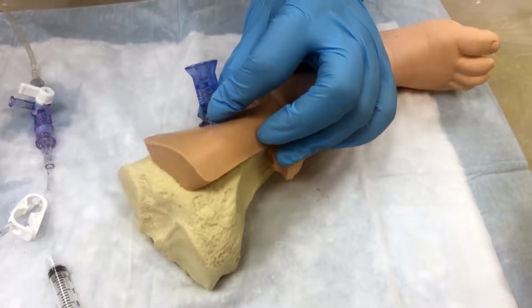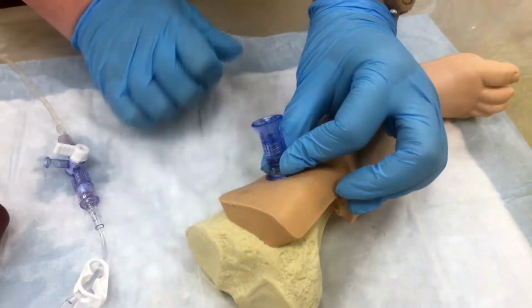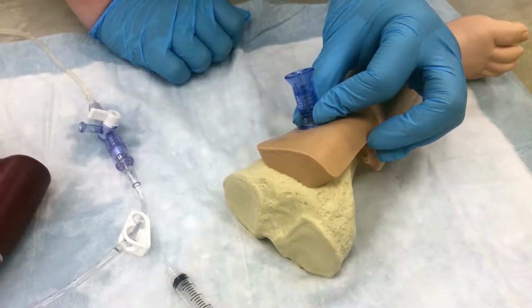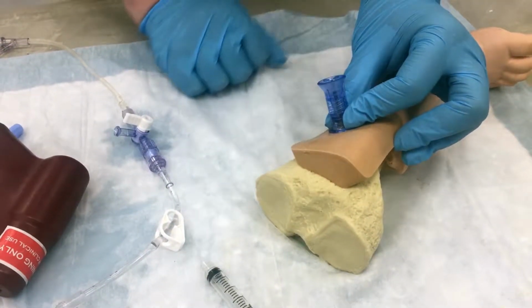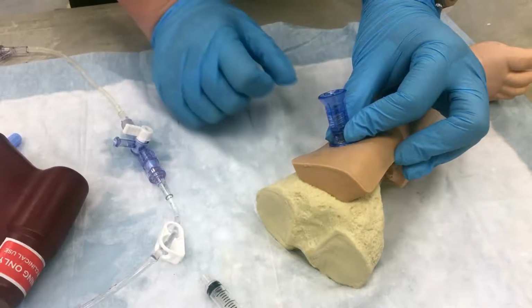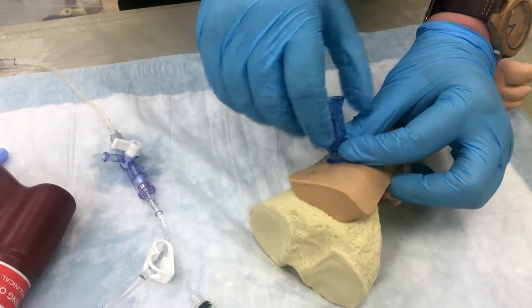Pediatrics: release the trigger when a sudden give or pop is felt, indicating entry into the medullary space. For adults, advance the needle set approximately 1 to 2 centimeters after entry into the medullary space. Stabilize the needle at the hub, disconnect the driver, and remove the stylet from the needle, placing directly into a sharps container.